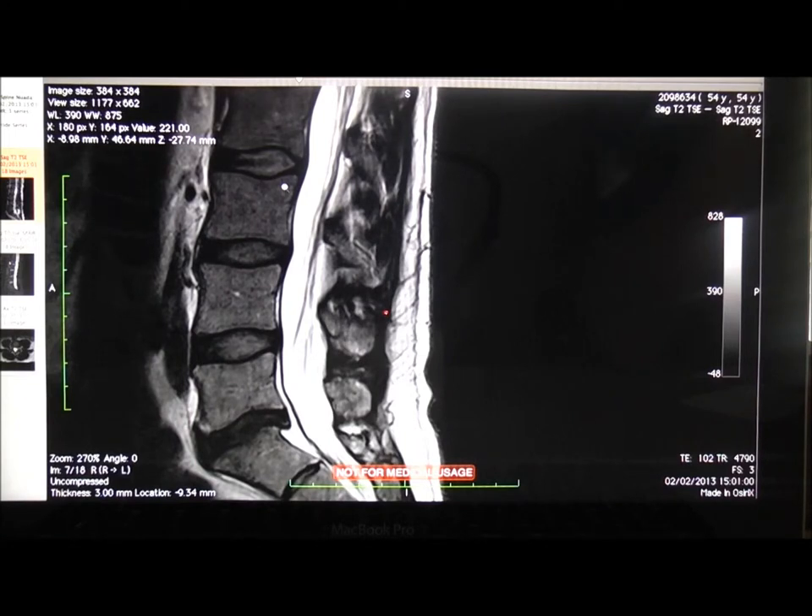Here we have a quick whistle-stop tour of an MRI scan. This is the spine in side view, or sagittal view as we call it. These are the discs in between the vertebrae. Hopefully you can see that this one is a bit damaged — it's different to the others, which have a nice nucleus. This one is starting to dry out a little bit.